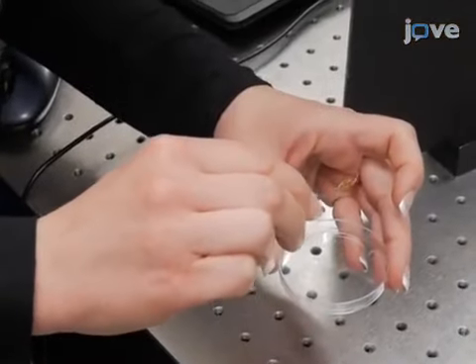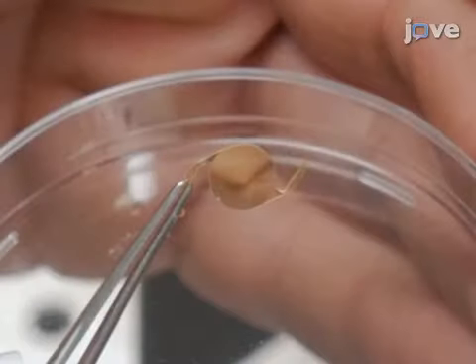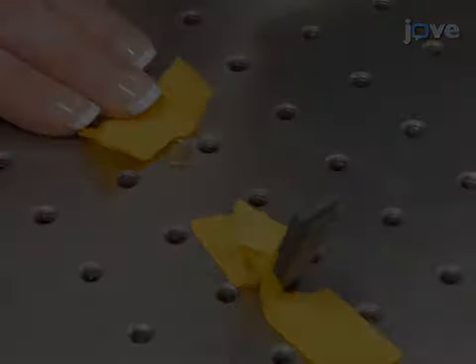Next, obtain the intraocular lens for the experiment. This multifocal optical lens will serve for this demonstration. Note the structure of the intraocular lenses.